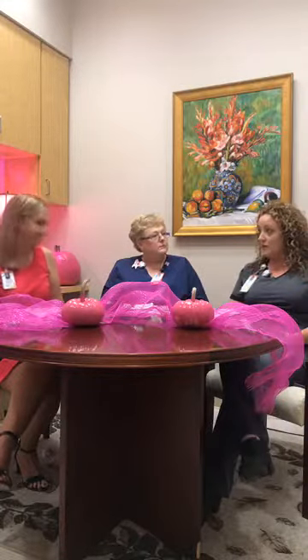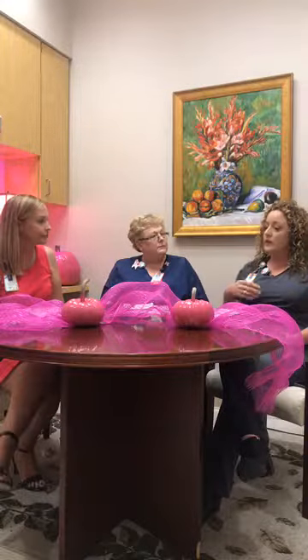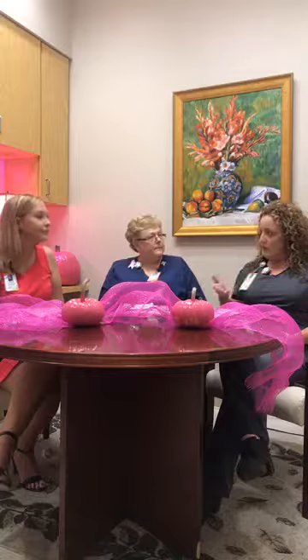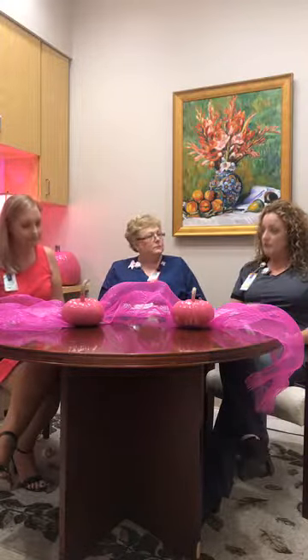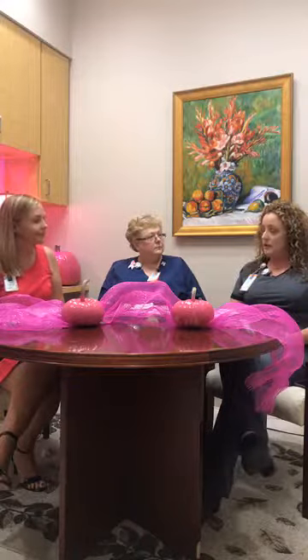When should women start getting their mammogram? Here at Princeton, we follow the guidelines of the ACR, which is the American College of Radiology. According to the ACR, a woman begins her yearly mammograms at the age of 40. Now, if you have a strong family history, other complications, or you've had a palpable abnormality, that is something you discuss with your physician and may vary on when you start your screenings. But the base guideline is that you begin at 40.